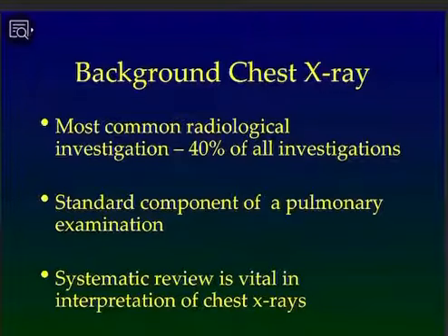It's the most common radiological investigation being performed. About 40% of all investigations which are performed are chest X-rays. It's a standard component of a pulmonary examination, and its systematic review is very important in the interpretation. What do you mean by systematic review? That means while reporting the chest X-ray, you must follow a scheme, you must follow a system, not haphazardly.